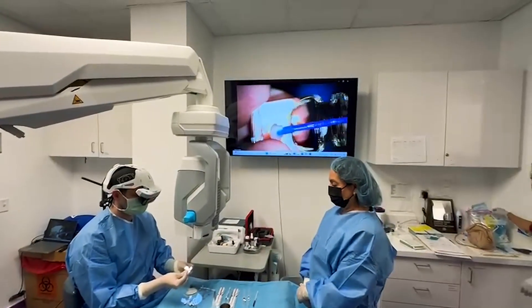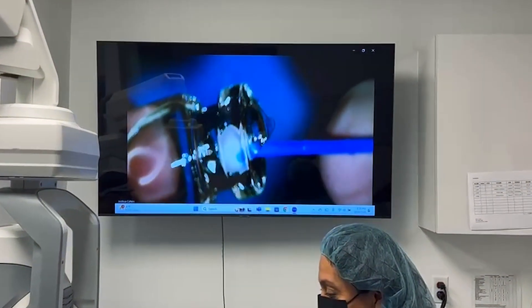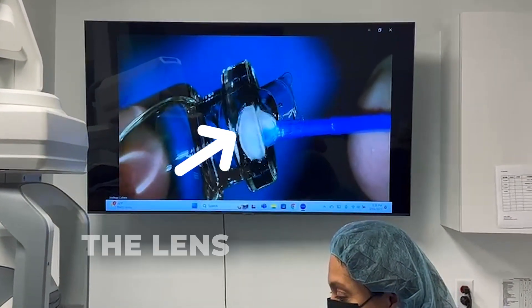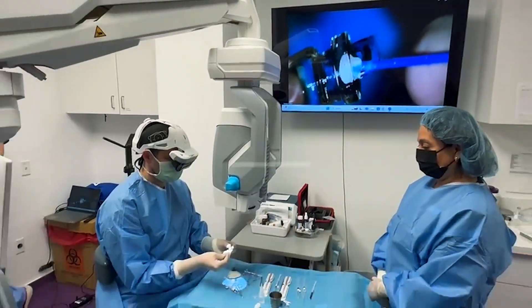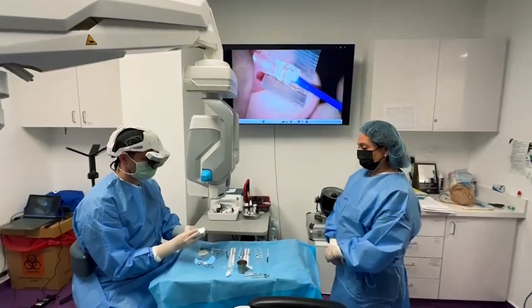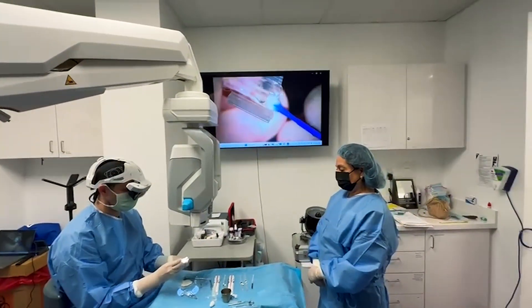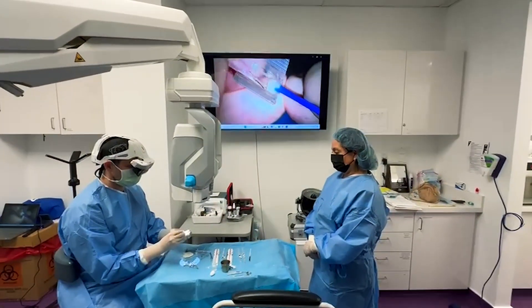After scrubbing, I need to get the lens ready. The ICL comes in these proprietary sterile packages. Every eye has its own custom lens designed and ordered for it. Here I am taking it out of the sterile solution. You might be able to see some tiny holes that help fluid circulate around the lens once it's implanted, and also help me orient the lens to make sure it's in the right position.